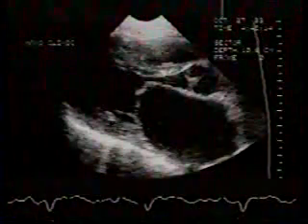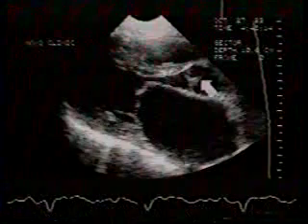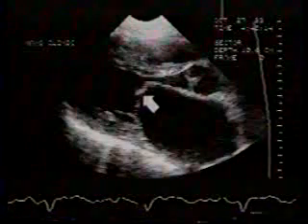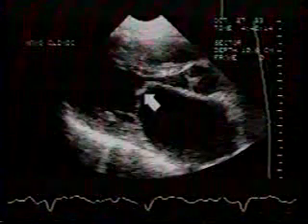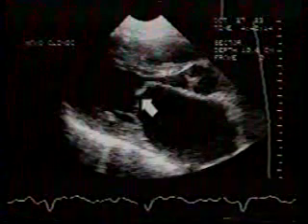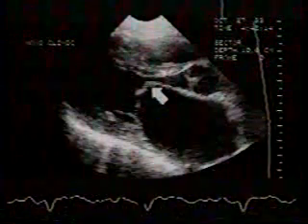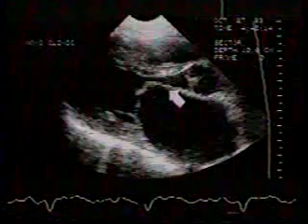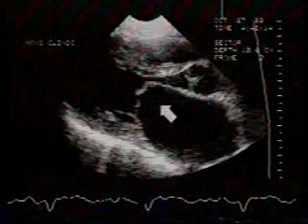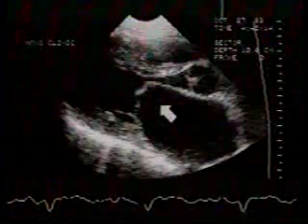This is the 2D echo from a 19-year-old female with mitral stenosis. In this diastolic frame, the aortic cusps have closed. The mitral leaflets are opened. Note that they are thickened, especially at the closing edges. The diastolic separation is reduced. The leaflets are tethered to one another, but the belly of the anterior leaflet, in this case, is very pliable and is moved toward the ventricular septum. This gives a characteristic hockey stick appearance to the anterior mitral leaflet. In real time, focus your attention on the characteristic motion abnormality of the mitral leaflets.